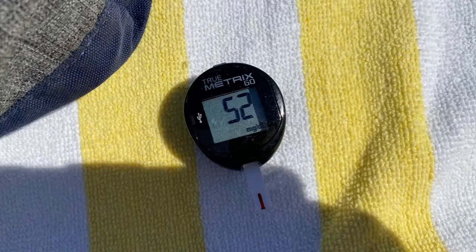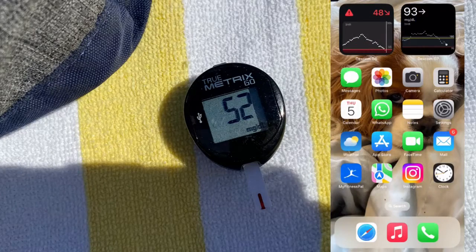Compared to my finger sticks, my Dexcom G7 overshot my blood sugars by 6 mg/dL on average and my Dexcom G6 undershot by 2 mg/dL on average. I should add that comparing a CGM result to a finger stick only really makes sense when blood sugars are stable, because the CGM measures in the interstitial fluid underneath the skin whereas a finger stick measures in the blood — and the fluid under the skin is about 10 minutes behind the actual bloodstream. So I tried to do most of those finger sticks fasting or when my blood sugars were stable, with a few done in extreme positions — like when blood sugar was low — to gauge performance in high and low situations.